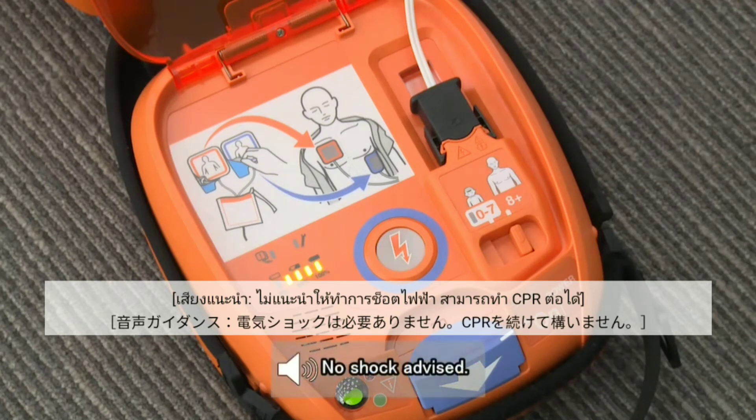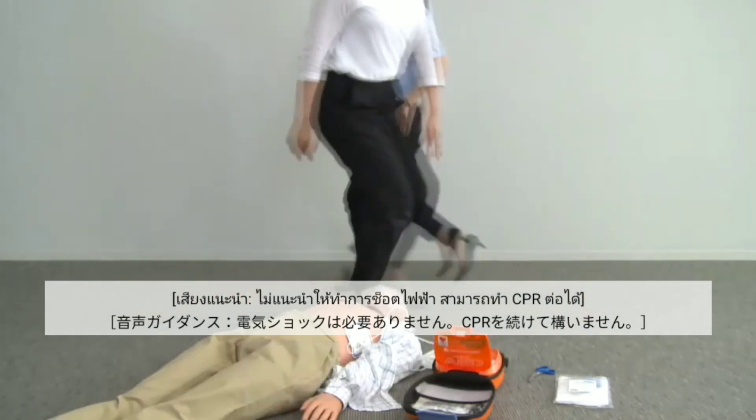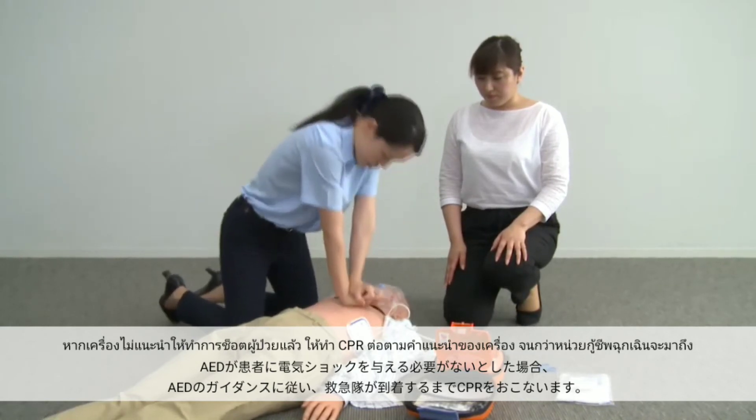No shock advised. It is safe to touch the patient. Start CPR. If electrical shock is not necessary, a voice instruction instructs you to immediately start CPR.